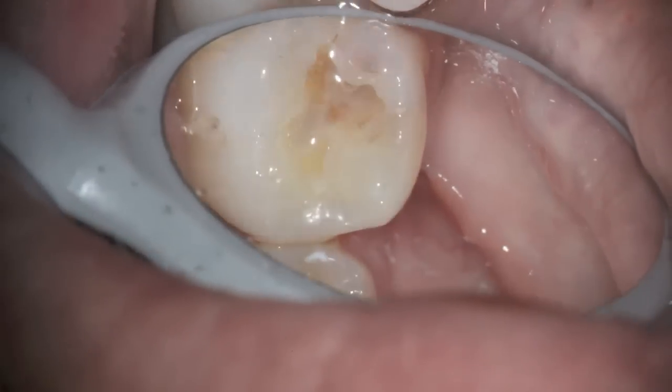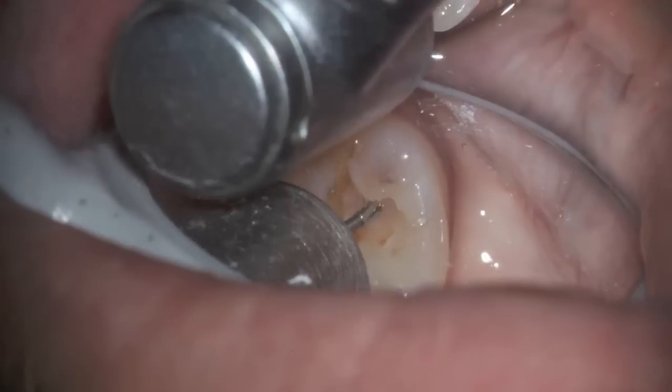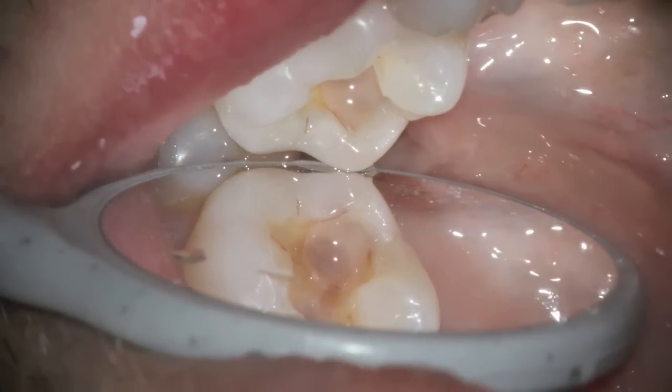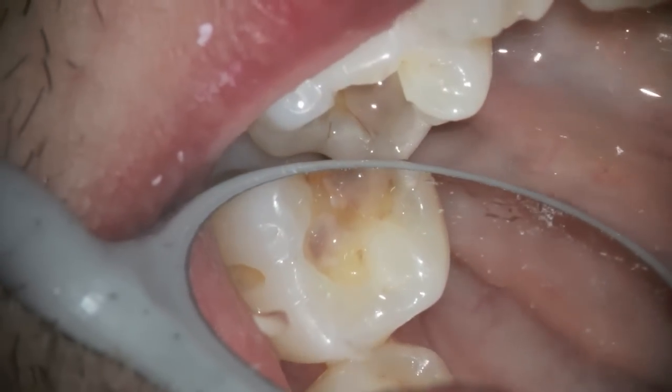So that would be whiter. You can see the decay that's up underneath this filling right now. Truly, the original filling material is in a number of different spots. You can watch and see the decay and the brown that's there.